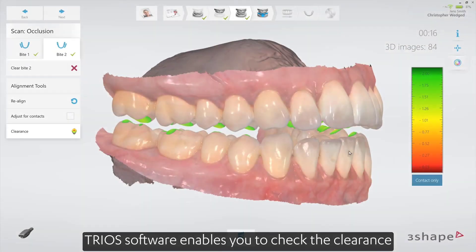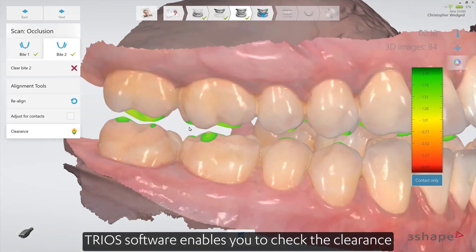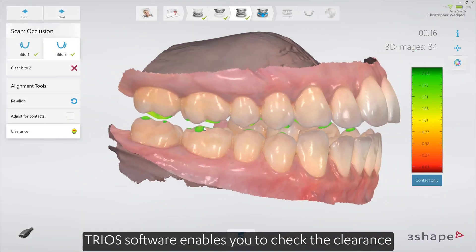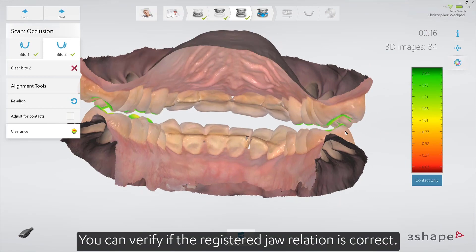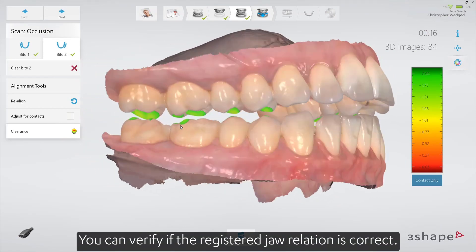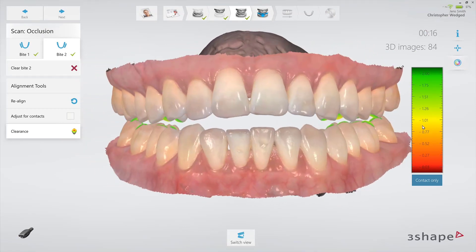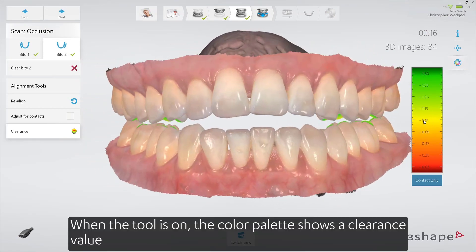Trios software enables you to check the clearance. You can verify if the registered jaw relation is correct. When the tool is on, the color palette shows a clearance value.